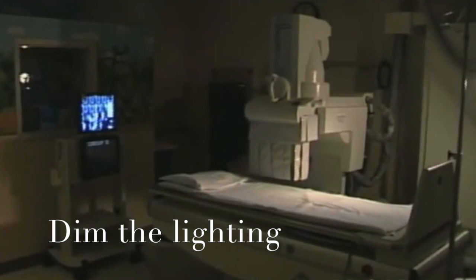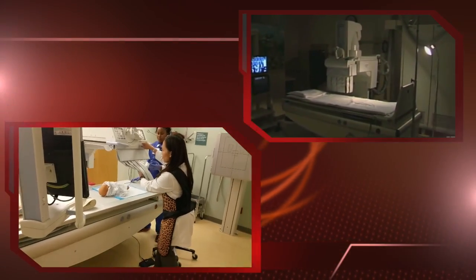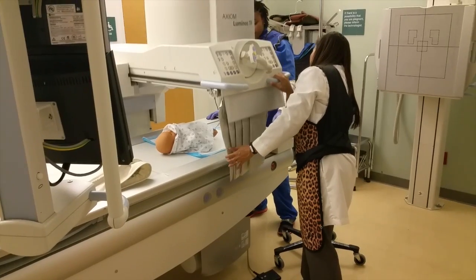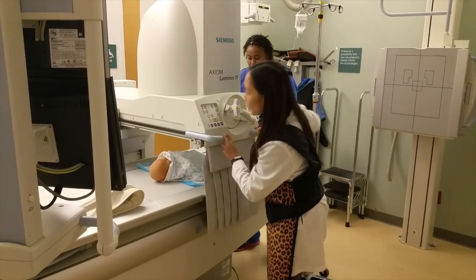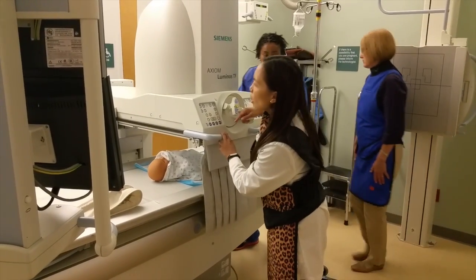The room lighting should be dimmed in order to view the monitors adequately without having to increase technical factors. The patient is placed supine on the fluoroscopy table, and the image intensifier or flat panel detector is brought close to the patient to reduce the dose to the patient, the technologists, and the parents.